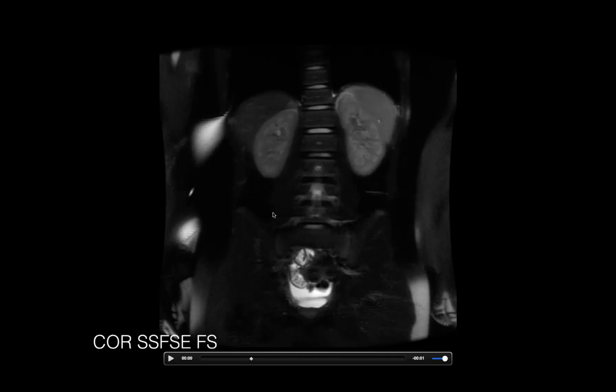Second, when you get far out from isocenter, you don't have the same field homogeneity that's in the center of the magnet. And so you have these areas of fat suppression failure. For instance, here you can see the bones in the hand, which have been heavily distorted, and the bone marrow, which normally contains a lot of fat, is not suppressed here. Here you see the bone marrow in this vertebral body. It's nice and dark. And here you see it bright.